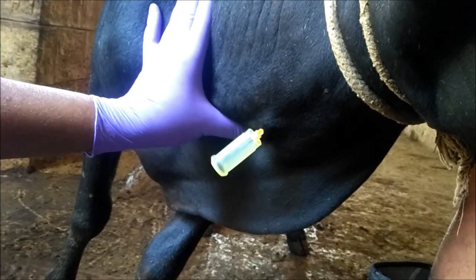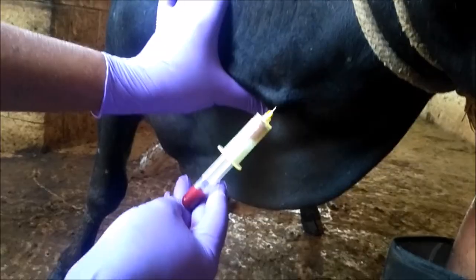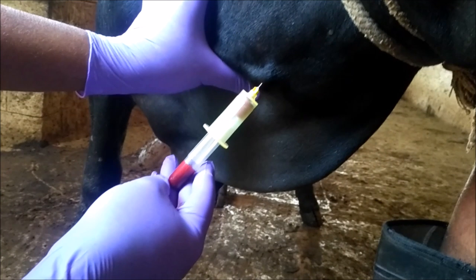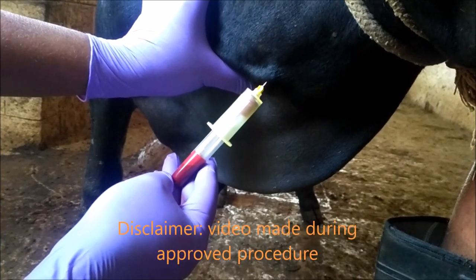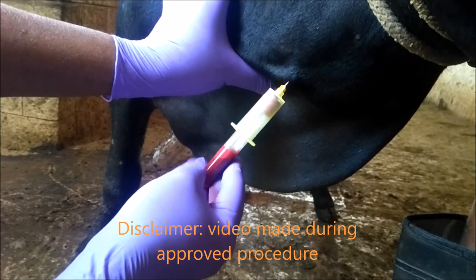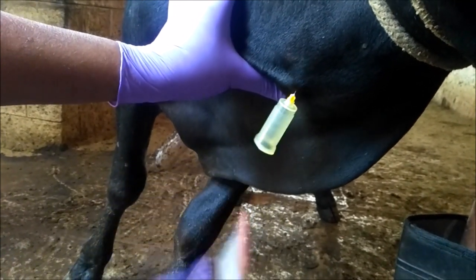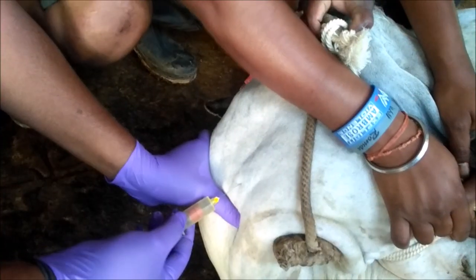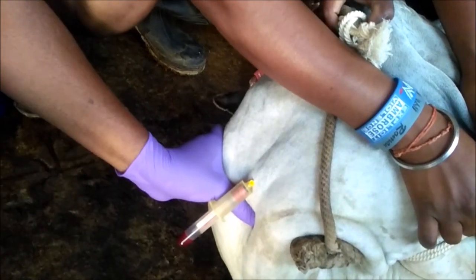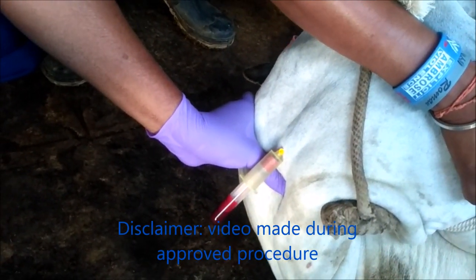First of all, we should restrain the cattle or buffaloes in the travis or chute in the standing position if the animal is highly ferocious. If the animal is cooperative, it can be collected directly from the animal in the standing position. If the animal is small, like a calf or heifer, and is a little excited or ferocious, it can be made to lie down on the ground in a proper position with the help of manpower.